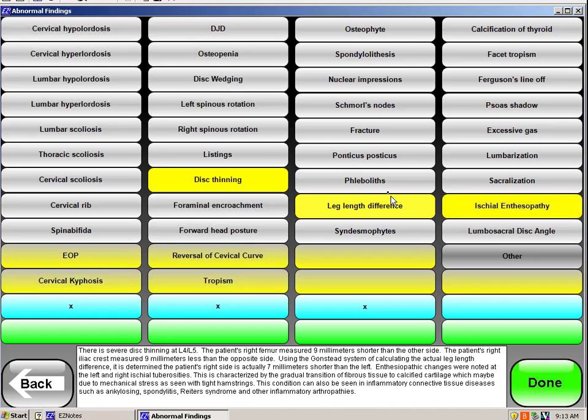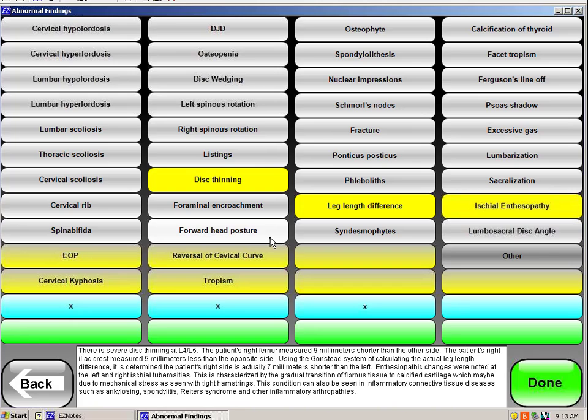You're putting whatever information's in there. I've gone into films and seen fecal bolus and indicated that. Excessive gas. Whatever is present on the films, I would indicate that. And then simply say done.